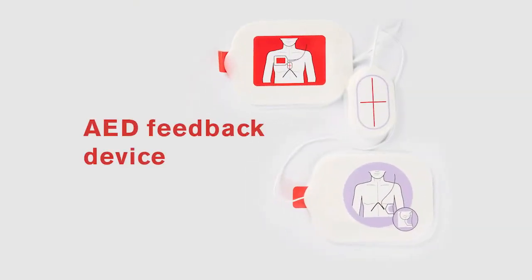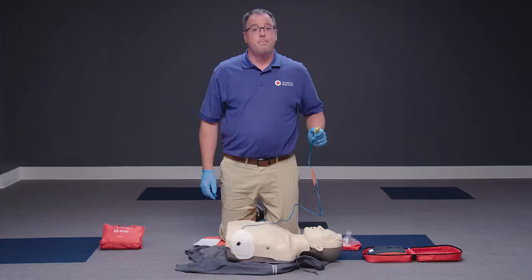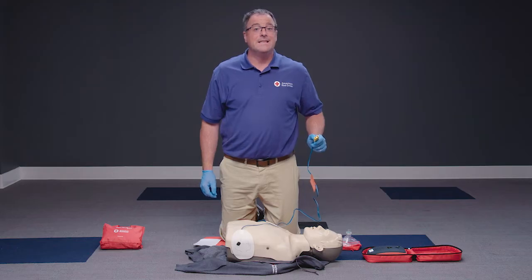Follow the diagrams and labeling of where each pad goes. If the AED pad has a feedback device, follow the manufacturer's instructions for use. Plug the pad connector cable into the AED if necessary, and prepare to let the AED analyze the heart's rhythm.